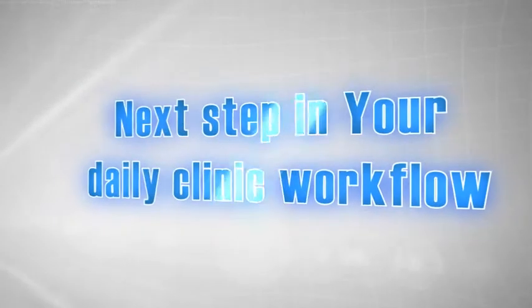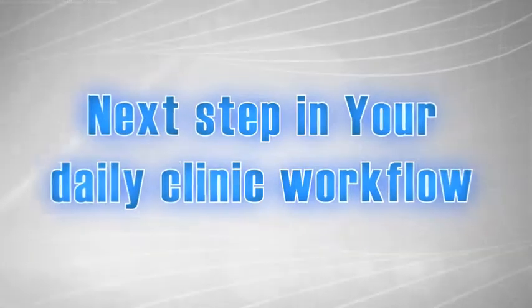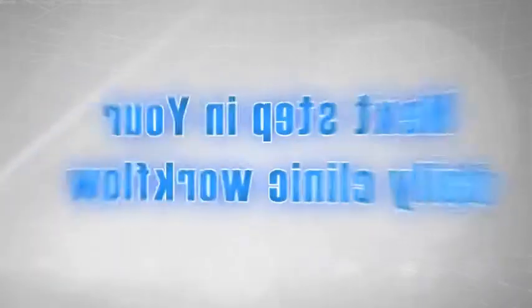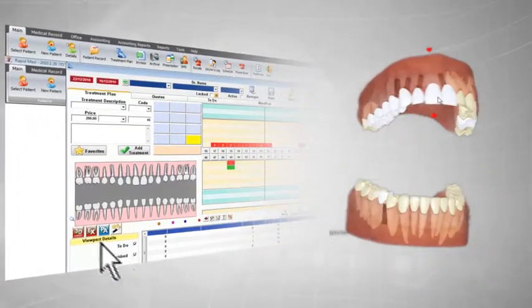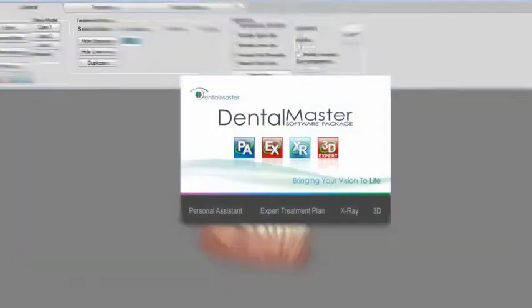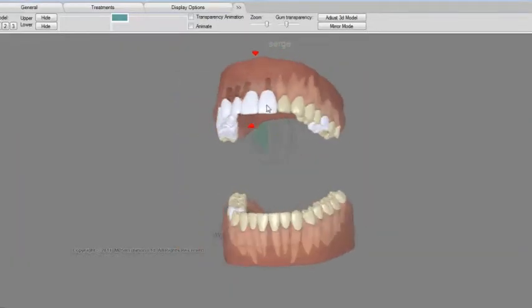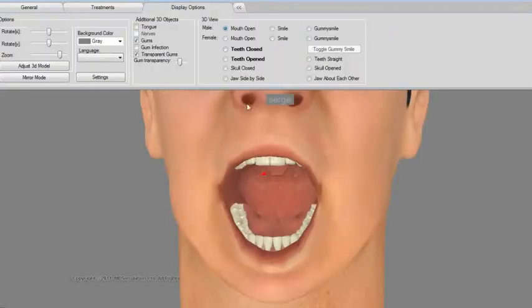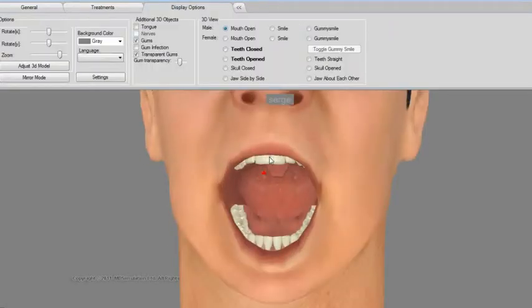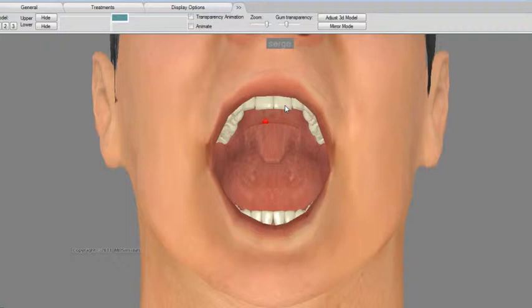DentalMaster is taking you to the next step in your daily clinic workflow. Just imagine if you could turn your patient's management data into a fully interactive 3D model with the click of a button. Well, now you can. DentalMaster now allows you to create and show a real 3D interactive model based on the patient data from your clinic management software.